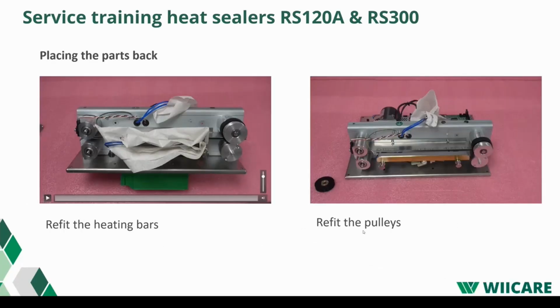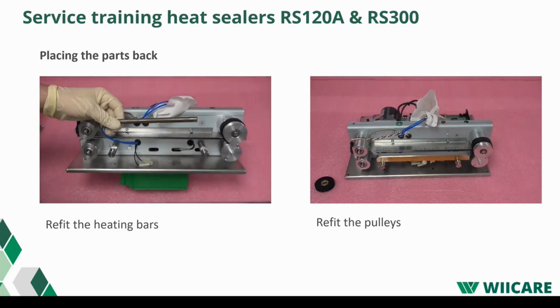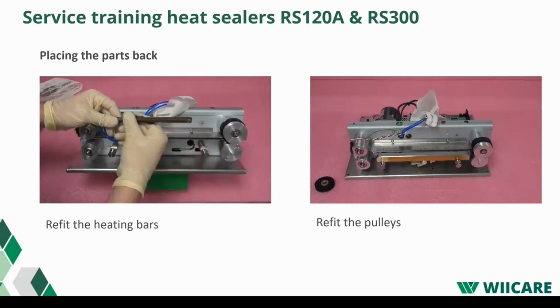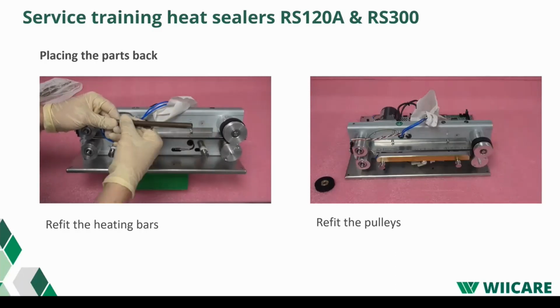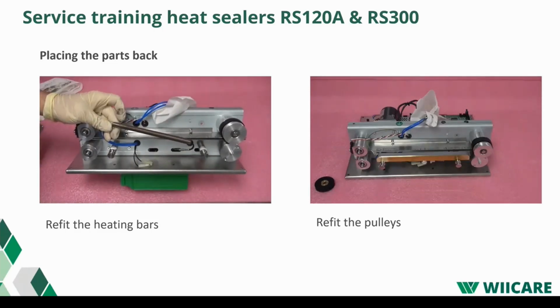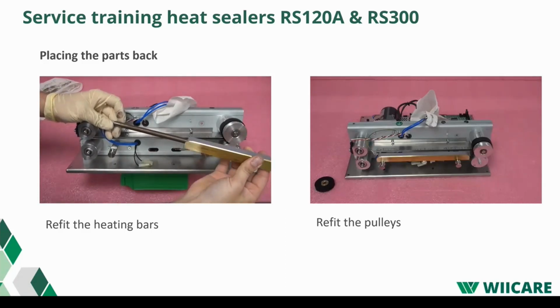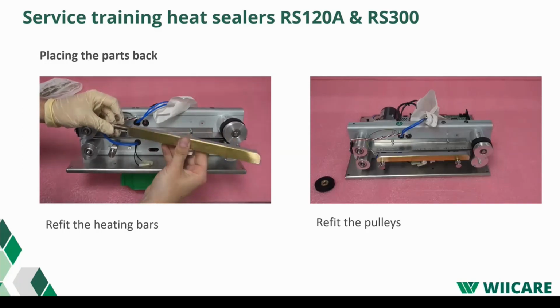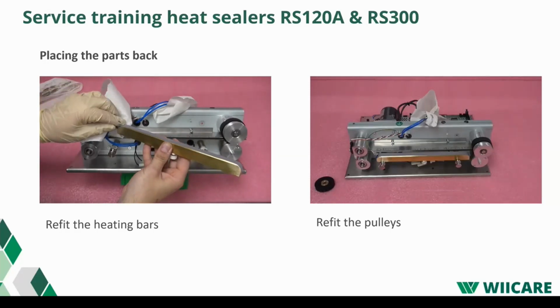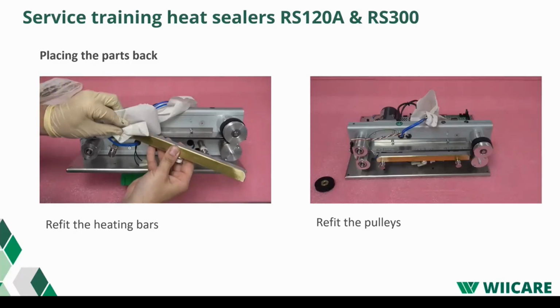These videos show how you replace some of the parts back into the heat sealer. Put the heating back in the bar. Make sure to put some copper paste on it. And be careful with the copper paste. Wipe off any excess if you get it on your clothes.